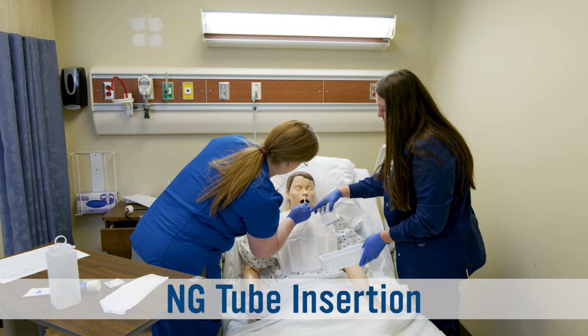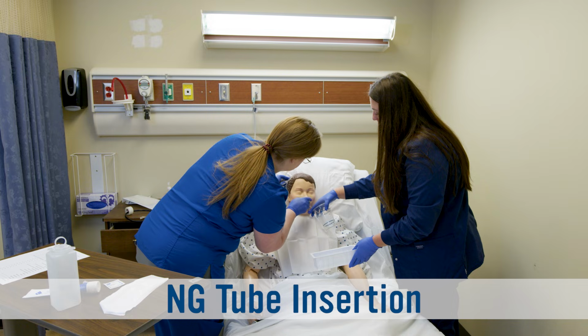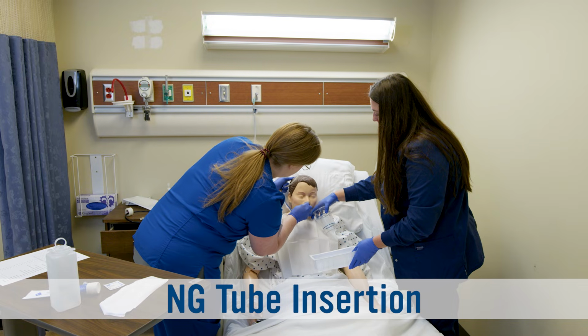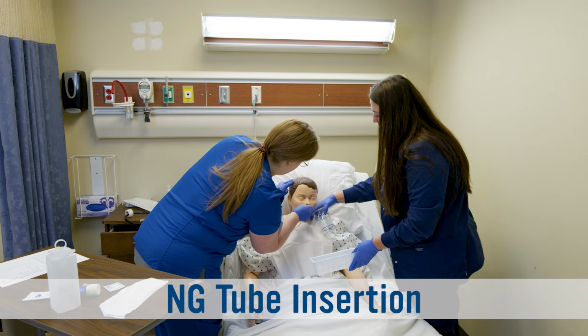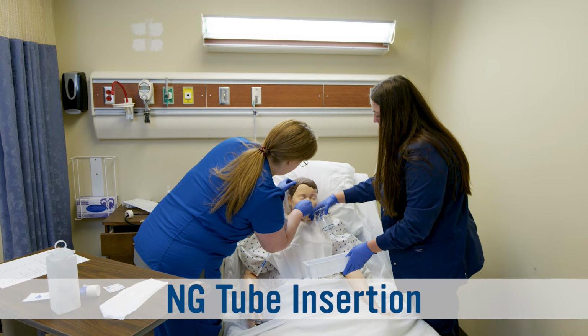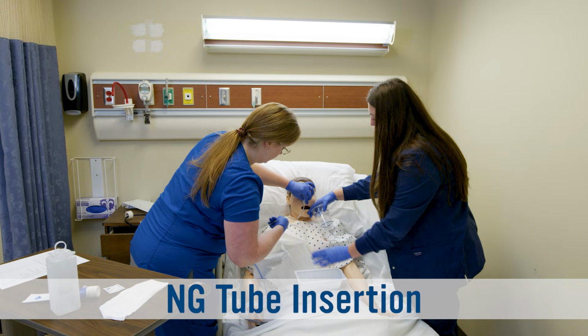Once I hit the back of the throat, you're going to tuck your chin down. You're doing great, Ms. Cook. All right, go ahead and swallow. Keep going. You're doing so good. We're going to help you feel much better. All right, you did so good, Ms. Cook. All right, now we're going to go ahead and tape this.